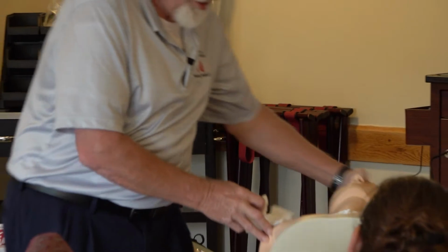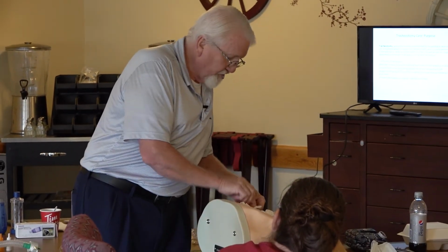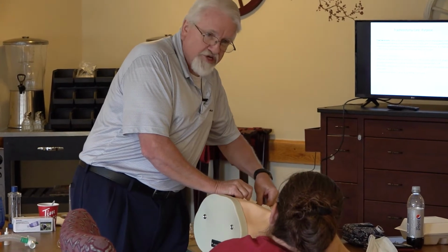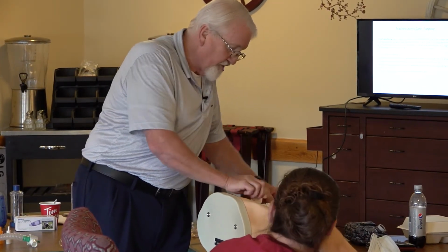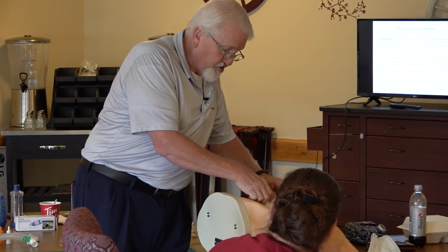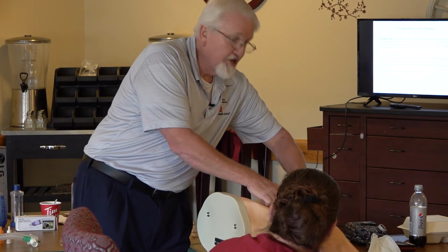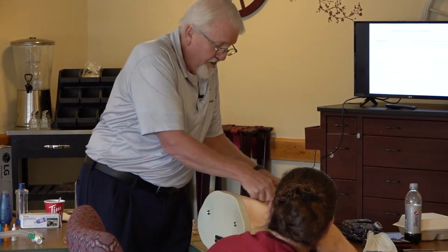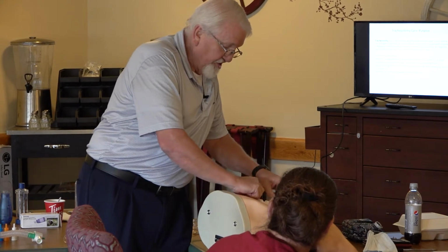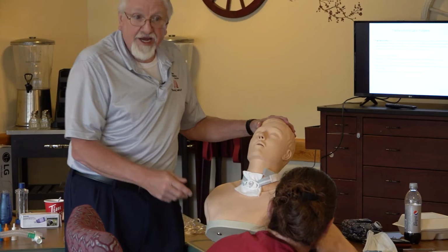And I'm trying hard to do this where everybody can see. We're just going to lift one side of the collar up a little bit and slide that up under there, and then slide it over to where it's positioned where it needs to be. And I'm going to do the same thing on the other side. Just lift up, slide it under there, and then position it properly to where it looks like that.